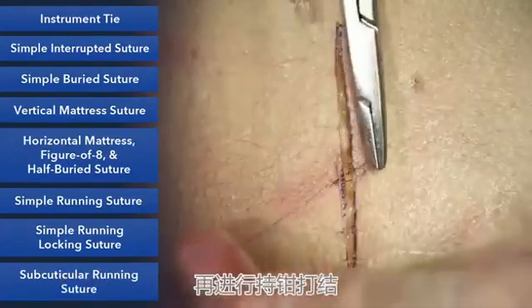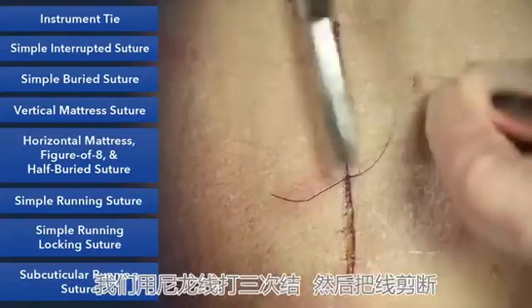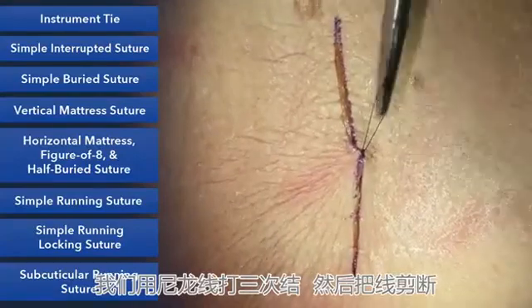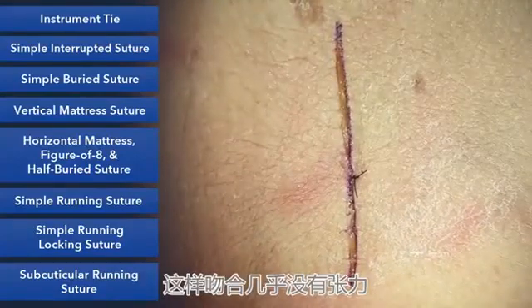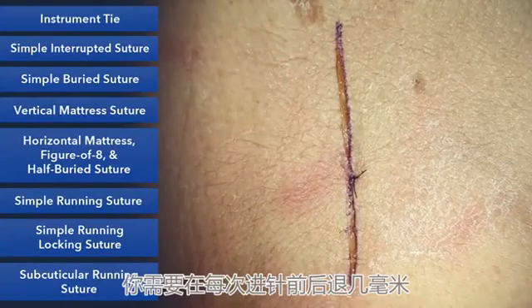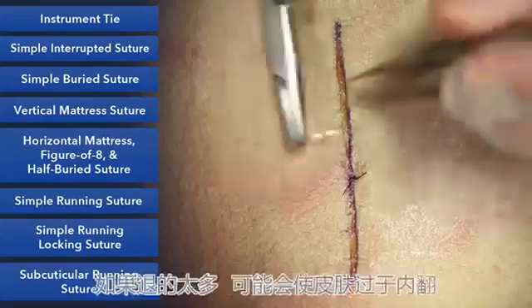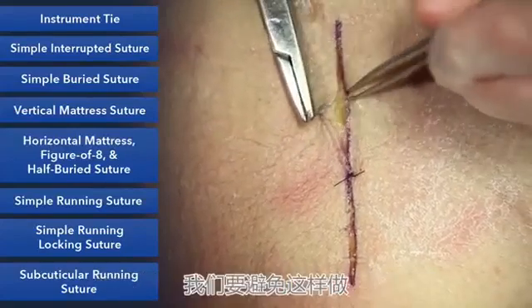Here we'll set up an instrument tie, and you can see here again we do 3 throws for nylon, and we'll go ahead and clip this. This is approximation without tension. You want to go back a couple millimeters for each bite. If you go back too far, it'll tend to invert the skin, and we want to avoid that.